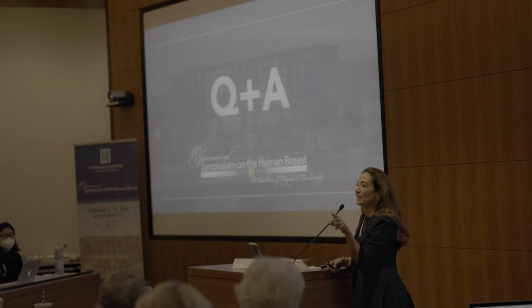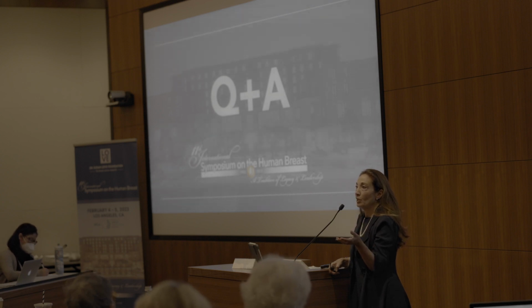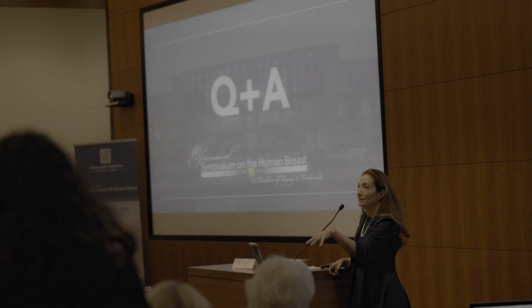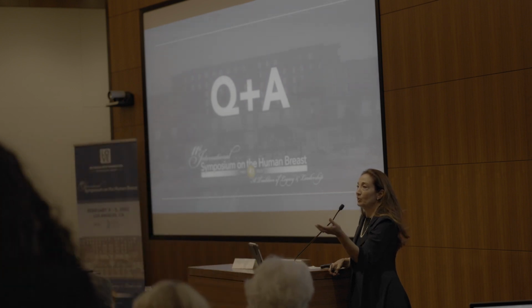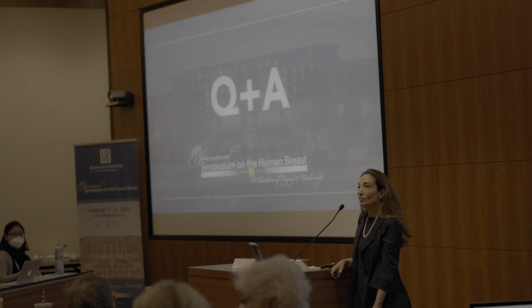And the DCIS, that was another interesting thing, the AI was never trained for masses representing DCIS. So if we added masses that were DCIS, it would really also improve the AI software. What was the concordance between the radiologist and the V-scan in the missed cases?